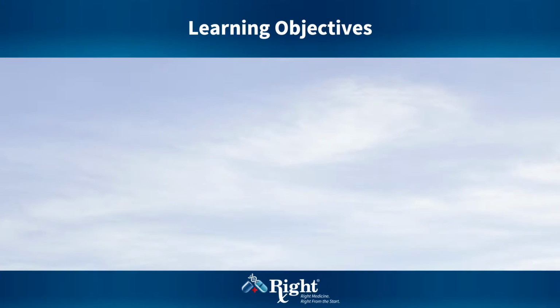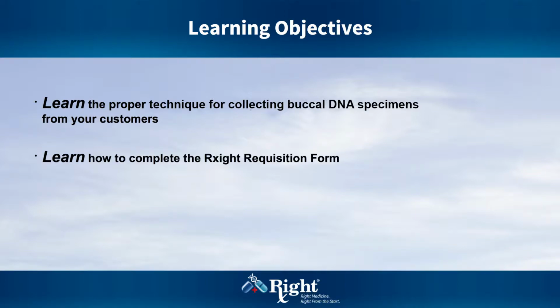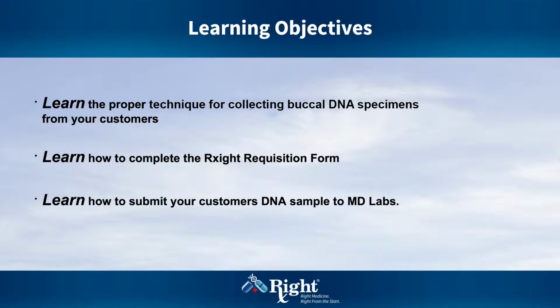The learning objectives for this session are: 1. Learn the proper technique for collecting buccal DNA specimens from your customers. 2. To learn how to complete the Rxight requisition form. And 3. To learn how to submit your customer's DNA sample to MD Labs.